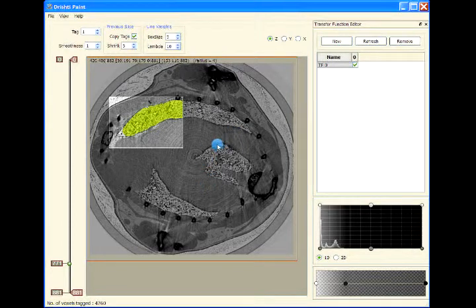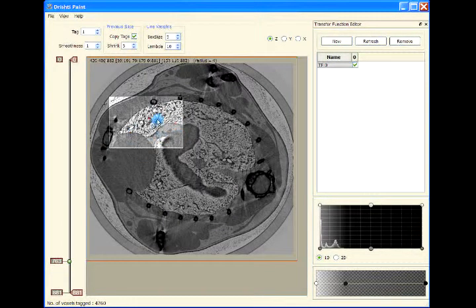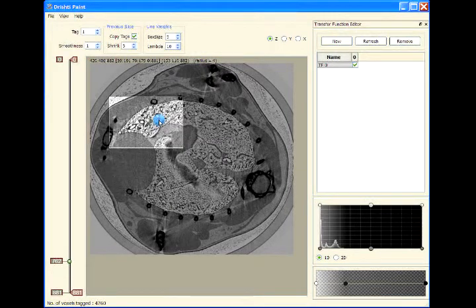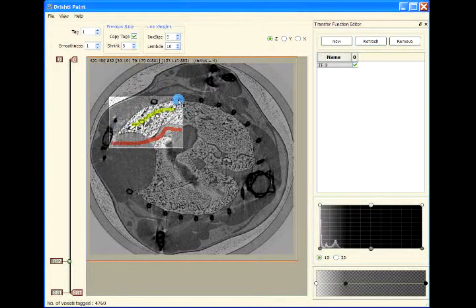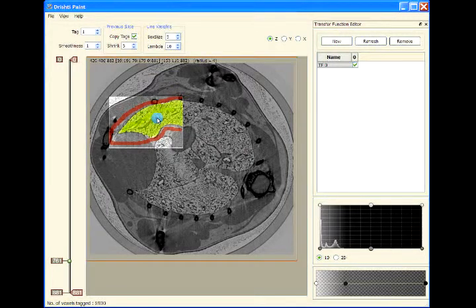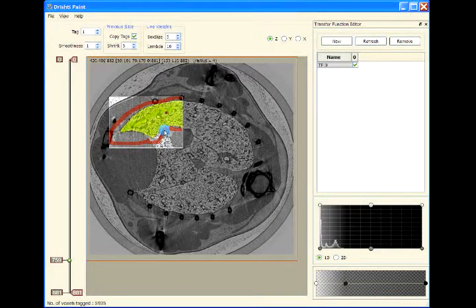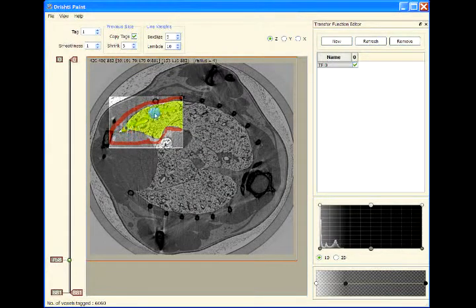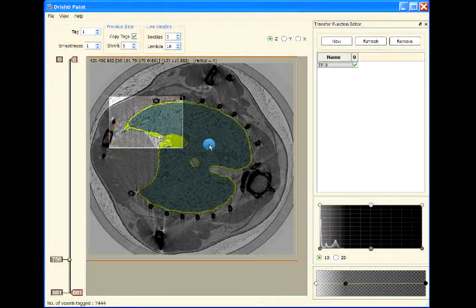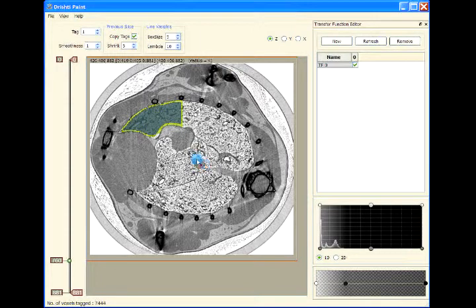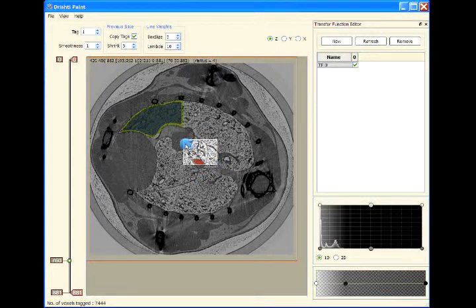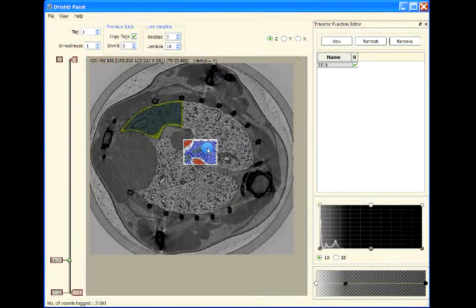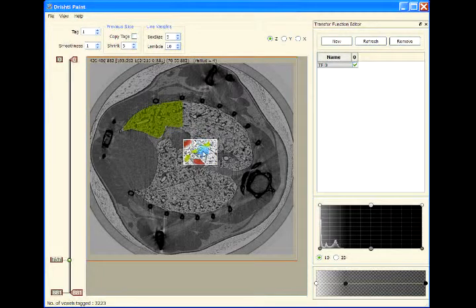For example, now this bit is a bit tricky here when it is joining up. Then for example this section here where there is a gap in between, so we can put background here and then turn off tags.